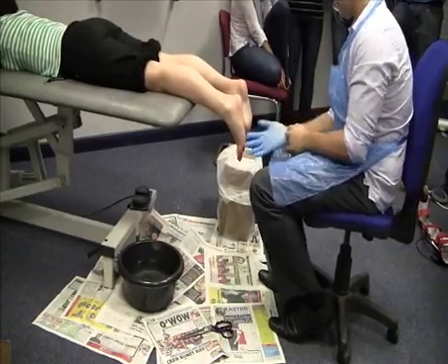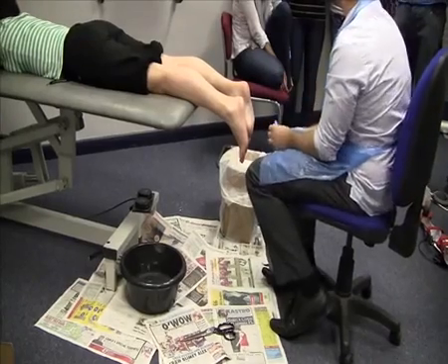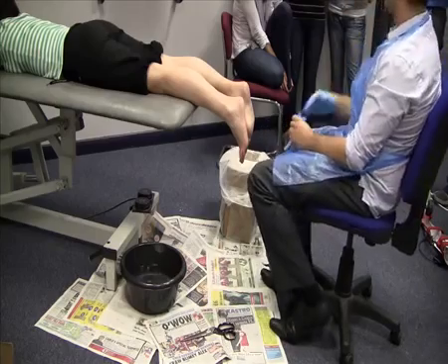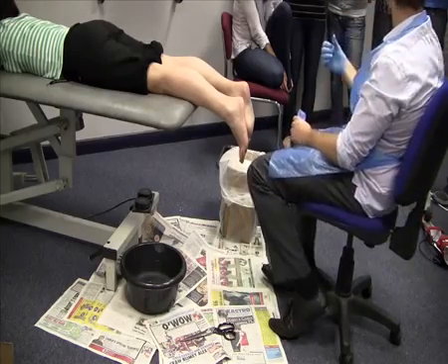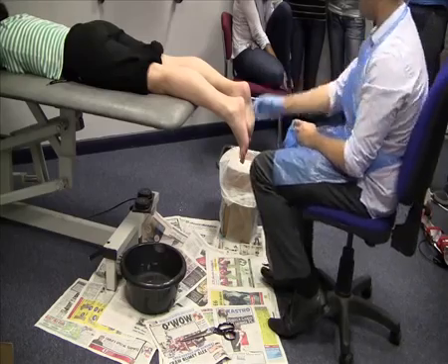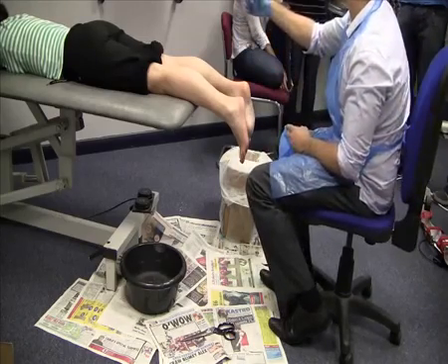Plaster casting. I prefer getting the patient on the front, mainly because with the patient on the back, I think there's a fatigue element that sets in. Does anyone do suspension casting? Where you hold the 4th and 5th and hold the foot up.